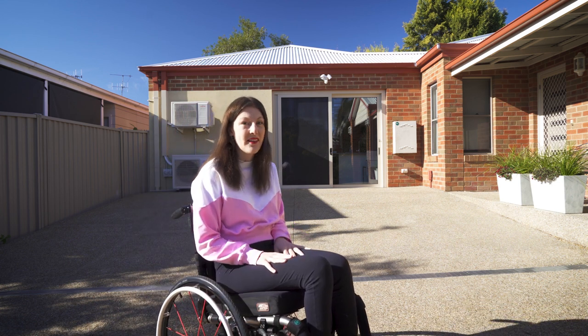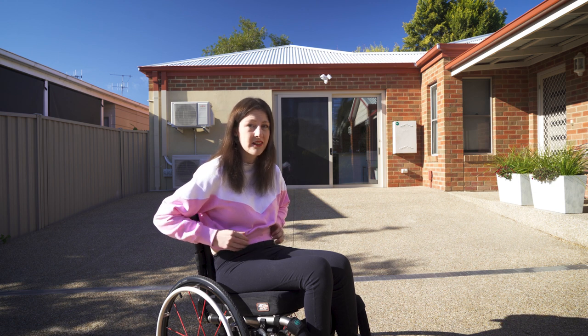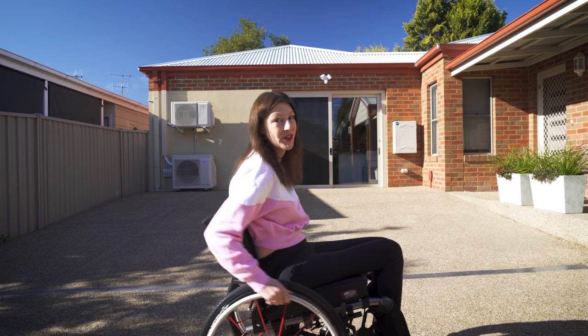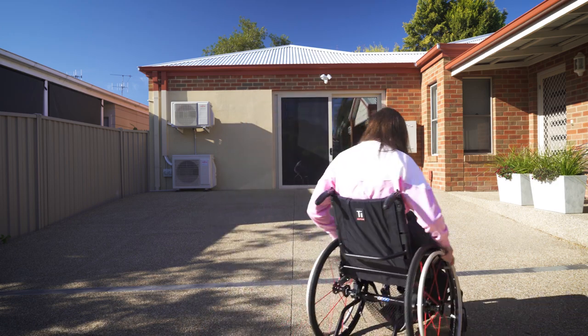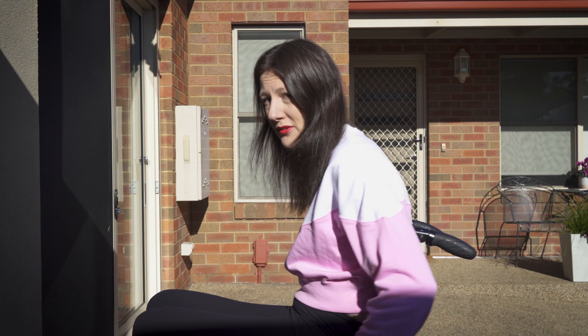Now there is another way you can go down. I am not a fan of this way, but it is a way that helps if you have a weaker trunk. So let's go to the top and I will show you. If you have a tendency to fall forwards when going downhill, there is an option to go backwards. I am not a big fan of this way, but it might help some people.